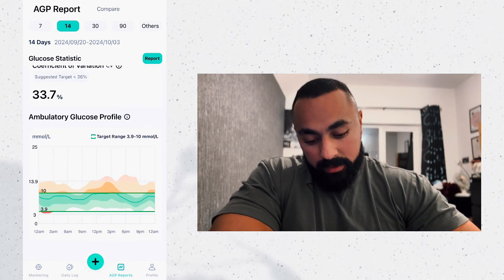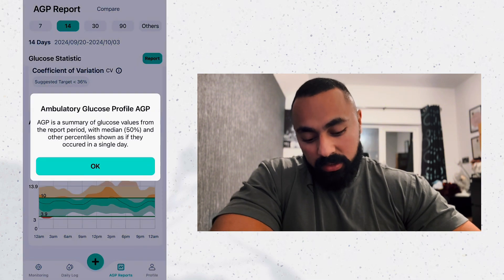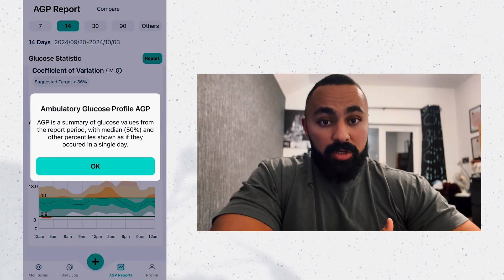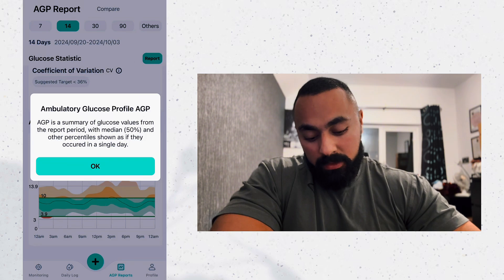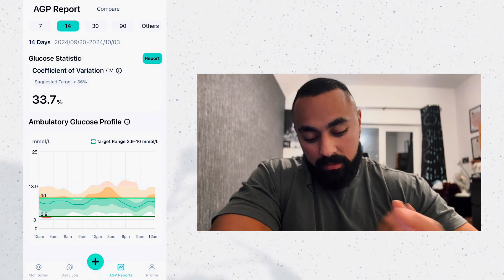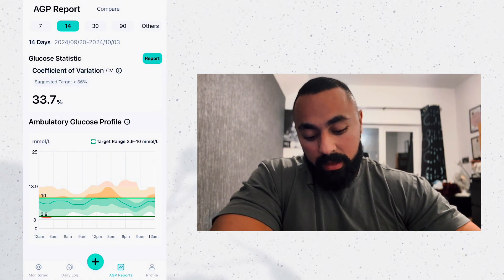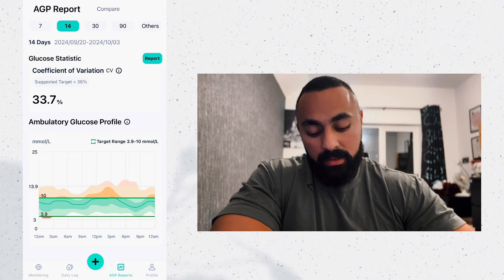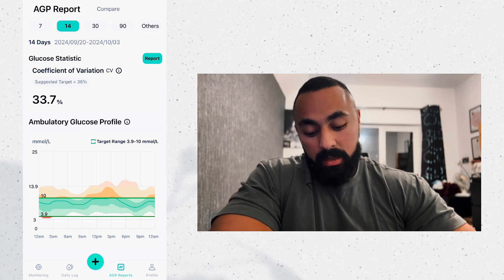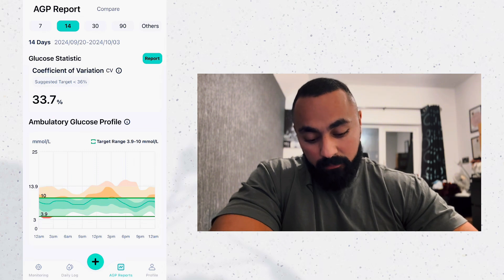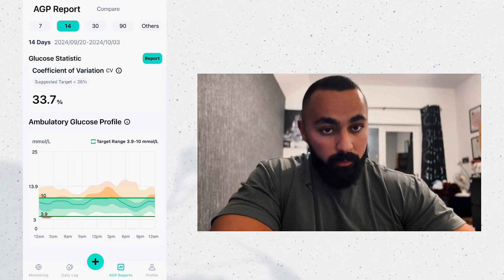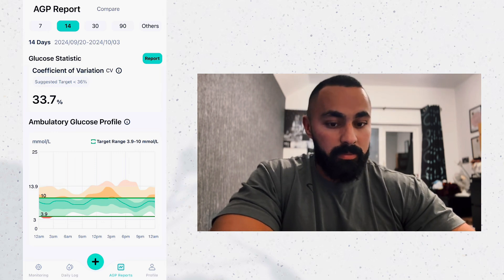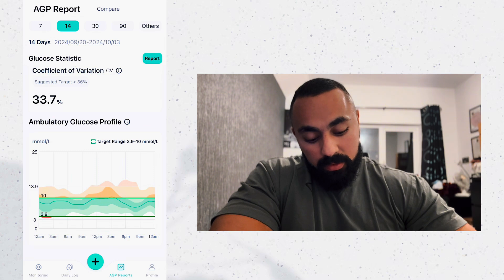Scrolling down, you've got the ambulatory glucose profile — the AGP. It's a summary of glucose values from the report period, with the median (50th percentile) and other percentiles shown as if they occurred in a single day. In simple terms, you want to be hitting the green zone — that green rectangle is your target range. Looking at my 14-day period, there's a lot of yellow, orange, and a bit of red. You want to minimize that as much as possible.